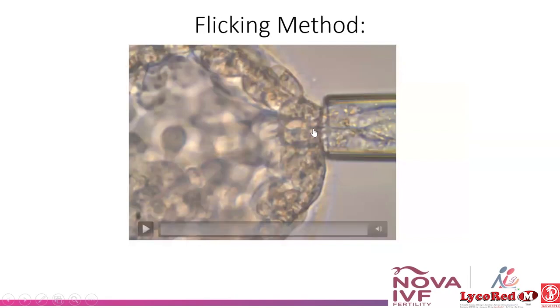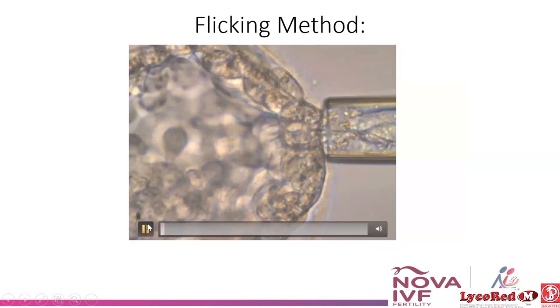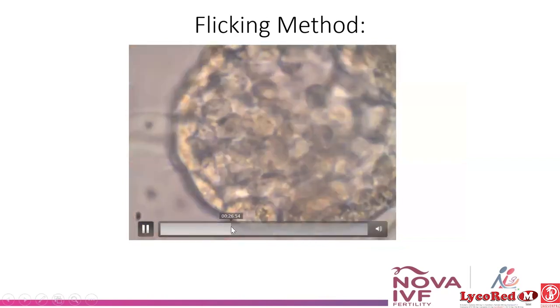Coming to the flicking method. I feel that the flicking method is very good, because here we can decrease the amount of laser shots. And when the embryo is fully hatched, we must do the flicking method only. What is the flicking method?